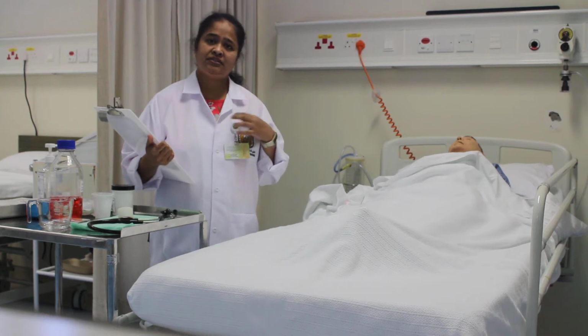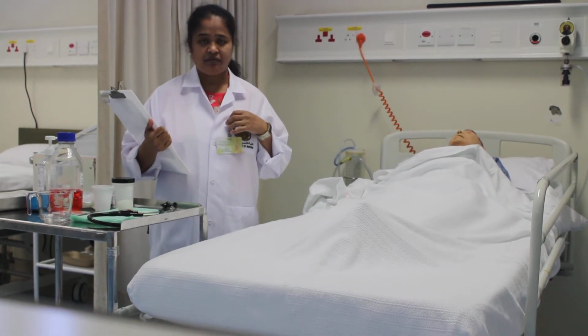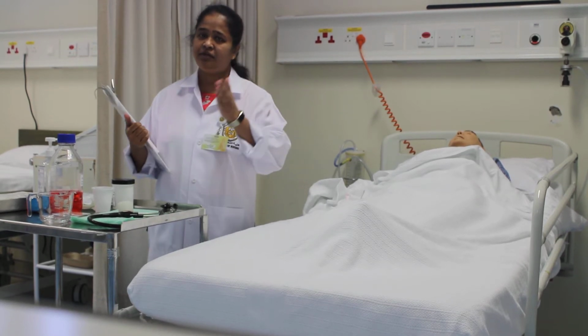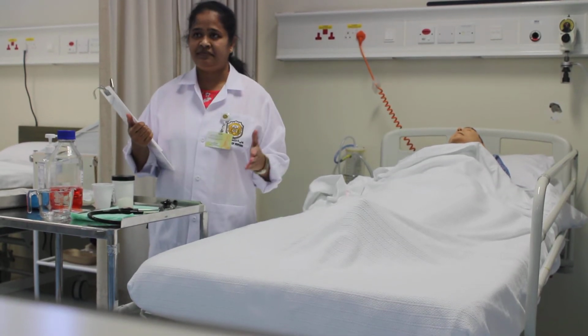Good morning, dear students. We'll be seeing how to insert an NG tube in this procedure. We'll have separate videos for removal and also for feeding.